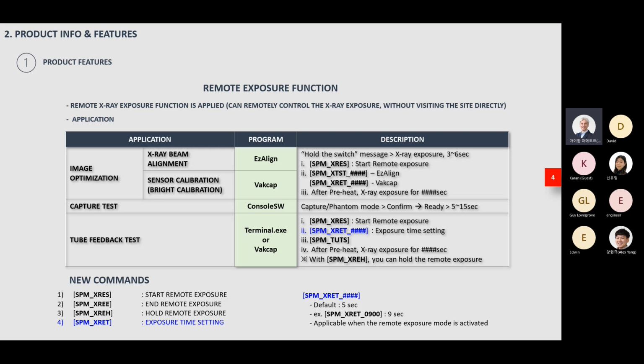So in order to do this, we had to add 4 new commands, and those new commands are SPM XRES. This is for remote exposure, and SPM XREE. This is also to end the remote exposure. The first one is to start, and this one to end. And in order to pause the remote exposure, you can use this command, XREH.